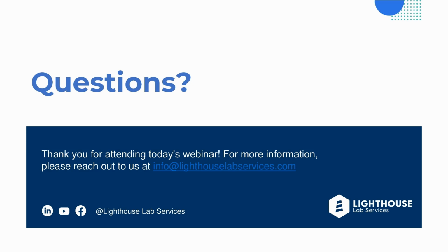Yeah, I agree with Jason on that. I can't speak too much to the quality difference between vendors for Z scanning, primarily because we normally use those focal points to generate a very good single layer scan, because that's more efficient in terms of data storage. And so comparison between Z stacks, I can't really give you information on that. We generally use a single layer scan that utilizes focal points so that everything's in focus.